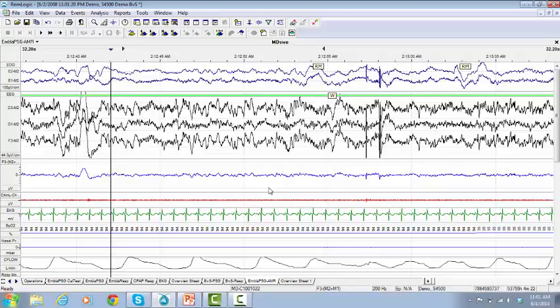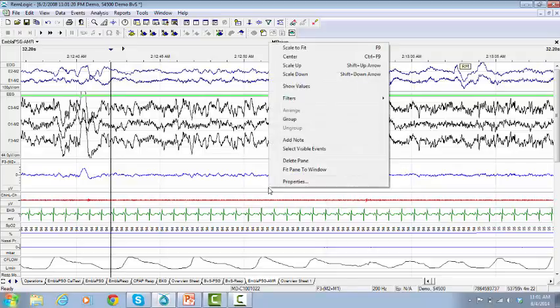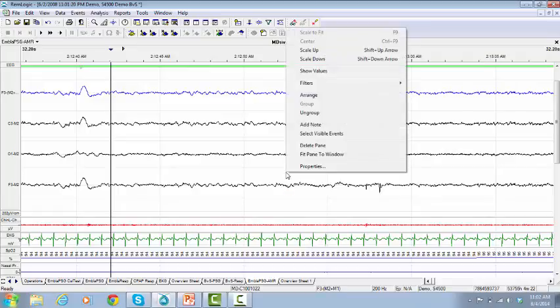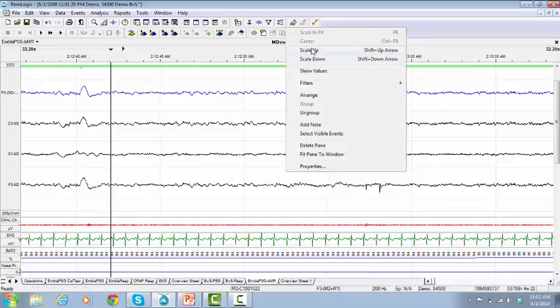To do that, right-click and from the Options window, select Group. And if you want to scale up these signals, right-click on the Options window and select Scale Up.